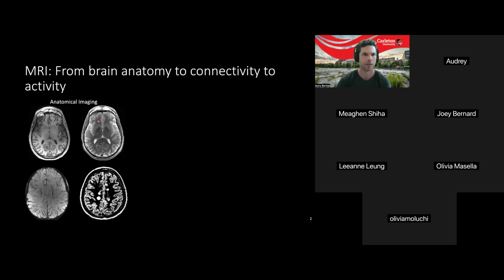All right, so let's start off with why MRI has been so foundational to the field of medicine. It's really because it's able to produce such a wide range of contrast types that have been invaluable in medical imaging and research. So you can see here different features of brain anatomy that are highlighted by such a wide range of different contrast types. And none of this requires contrast agent injection. It just depends on how we acquire our image.